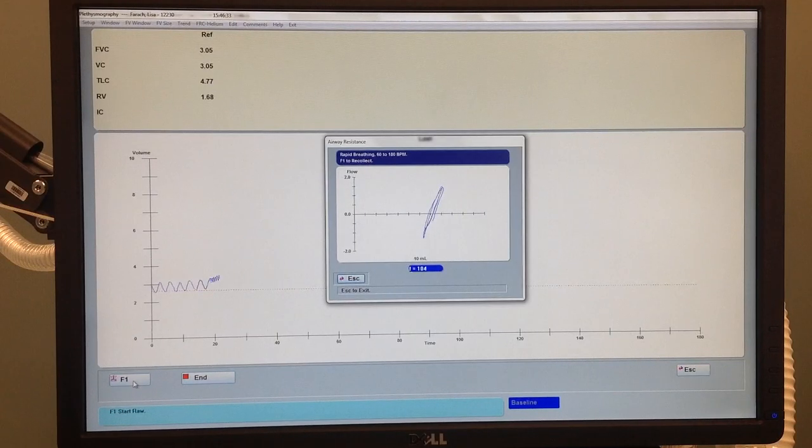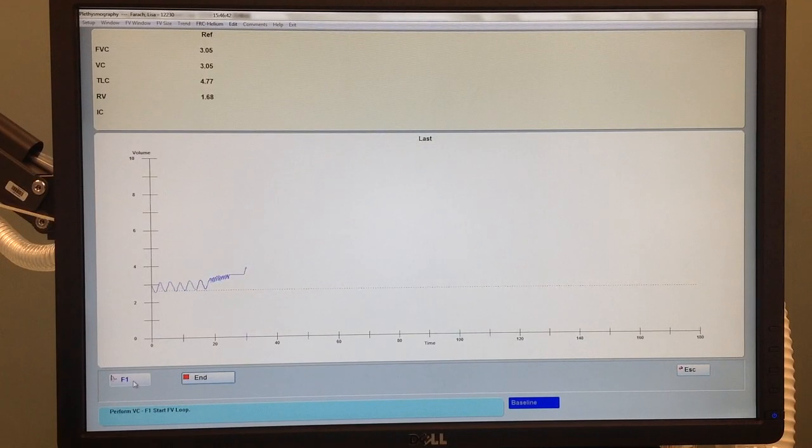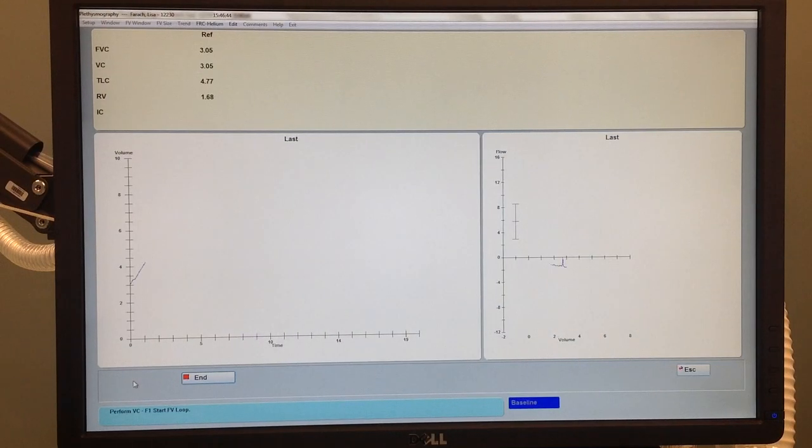F1. Keep going, doing good, doing good. Keep going, doing good. Okay, big breath in. F1. And out. Blow, blow, blow, blow, big blow, blow, blow, a little bit longer, a little bit longer.